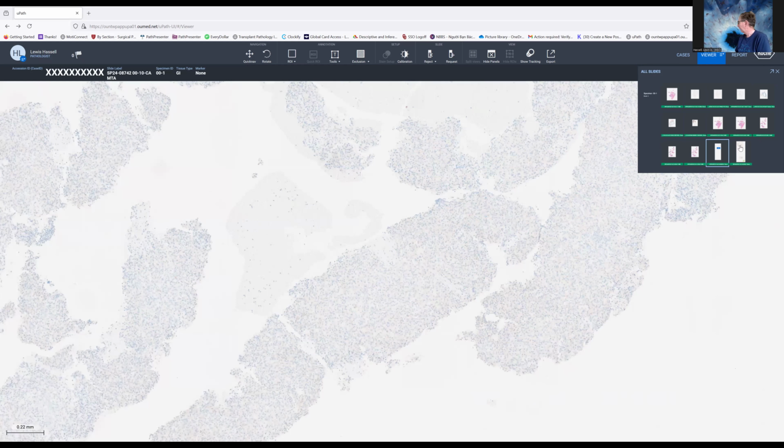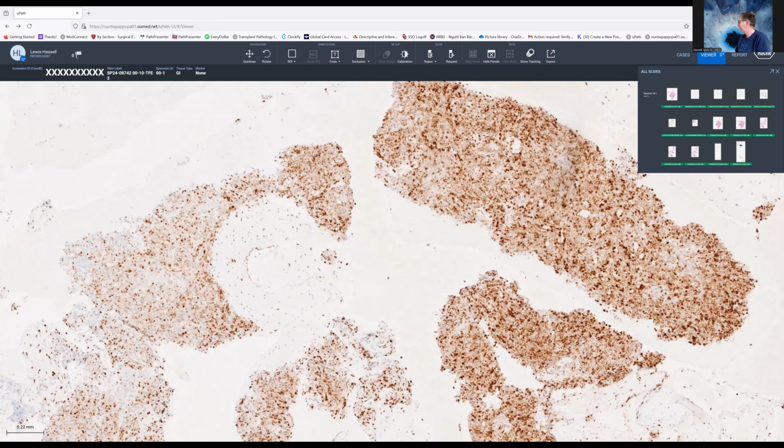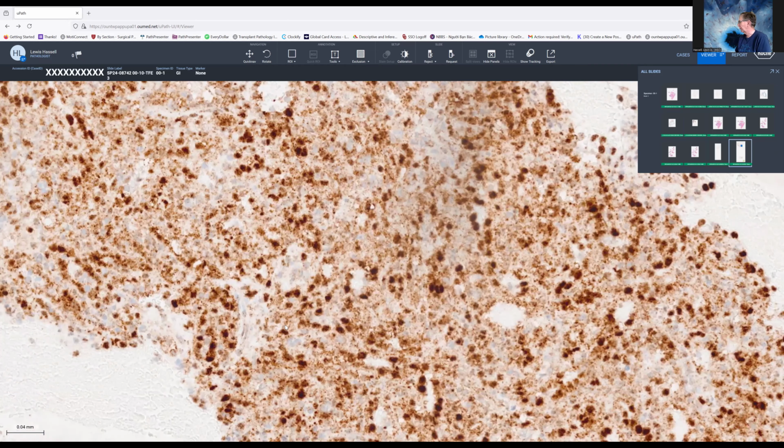However, in contrast, we also did the protein marker TFE3, and here you can see that this is nicely positive with this marker, giving us abundant granular cytoplasmic staining as well as pretty strong nuclear staining.